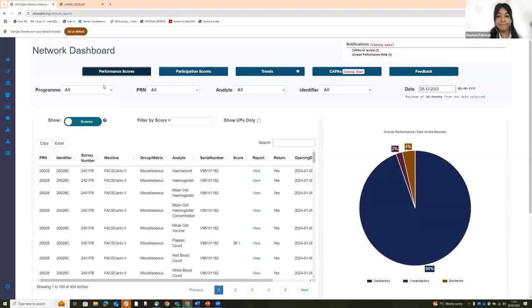So with DIs, the DI is showing you the deviation from the mean at that particular survey. And your performance score is an accumulation of your scores over the last 3 surveys or 6 specimens. So in a way, it's about reviewing those independently of each other, because as I said, the DI is showing you what's happening at that given survey. So what you want to note with your DI is, yes, you will have your own internal actions.